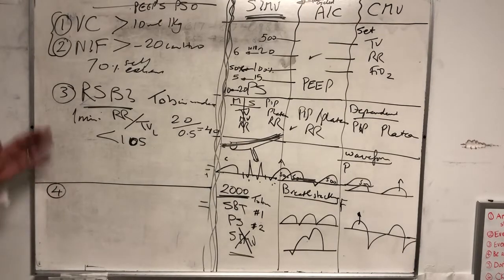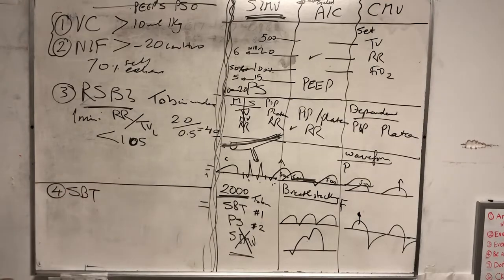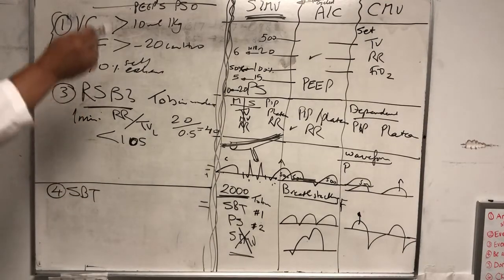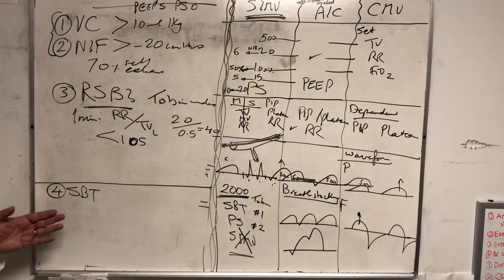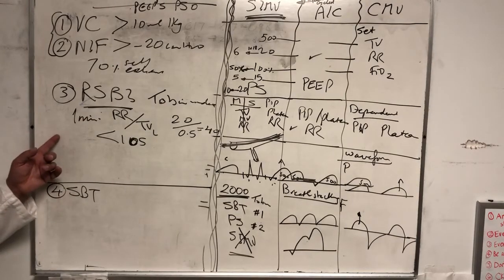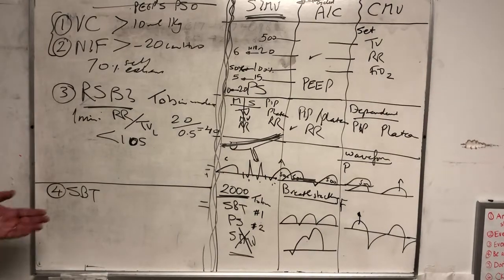Now the next one is the SBT, which is also Tobin, right? So all of the above, when compared with SBT, like these three compared with SBT, showed that there are potentially successful extubations that these are missing, right? It was a small study, but it just makes sense that there are some potentially successful extubations that were missed, because the SBT is basically trying to simulate exactly what the patient is going to be dealing with, right?